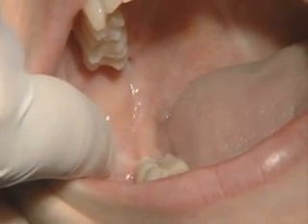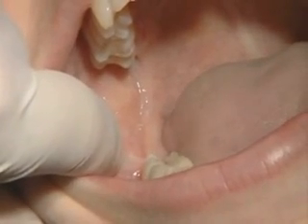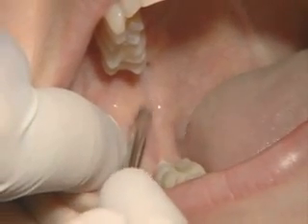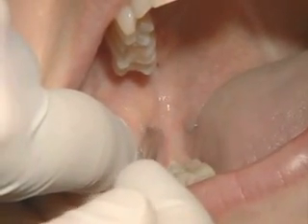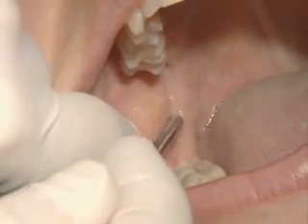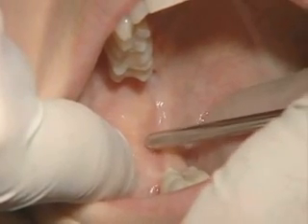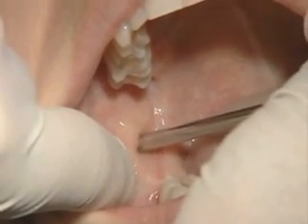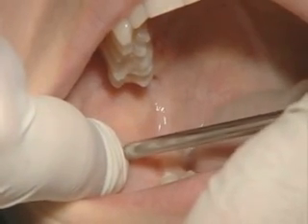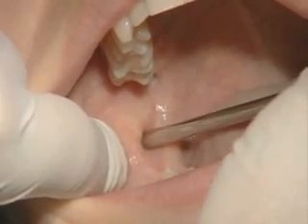Then by retracting your finger out laterally again and resting on the external oblique ridge, you expose the pterygotemporal depression, which is this depression shown at the end of the probe here. It is within this depression that the needle will be inserted. The medial border of the depression is the pterygomandibular raphe, and again the needle insertion will be within that depression, lateral to the raphe. The height of insertion will be roughly the midpoint of your fingernail, anywhere from the midpoint to the height of your fingernail, and that determines the correct height of insertion.